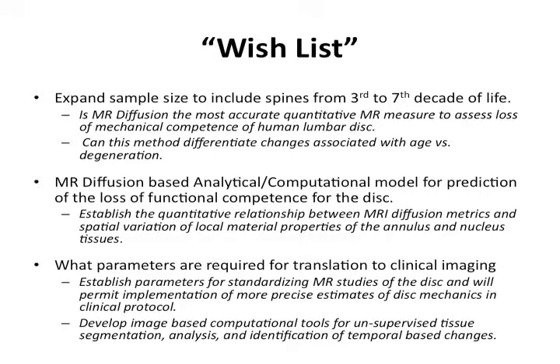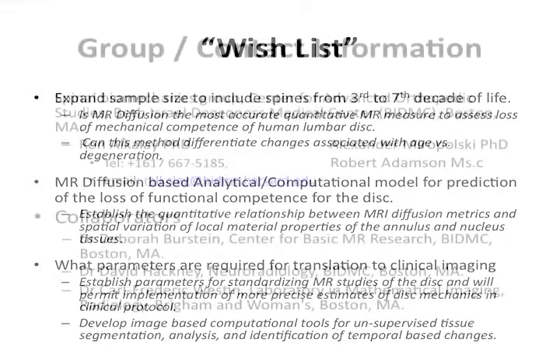In thinking about our study, we obviously need to understand whether this protocol can differentiate the effect of aging, the natural course of aging, versus degenerative effect. We need to establish a computational model to predict what's going on with the disc. And if we are ever to move this to the clinical arena, this being a highly poroelastic, history-dependent joint, we need to understand which parameters we should use to standardize the image, particularly what we should tell the patient to do prior to the imaging, and then come up with an unsupervised imaging method to allow clinicians to do this analysis.